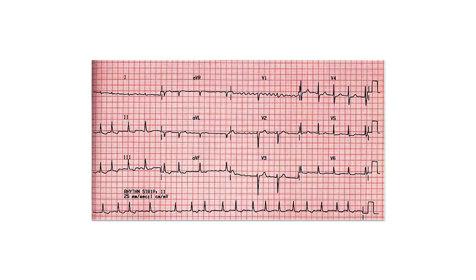Yes, and I remember a patient who came in with atrial fibrillation and with a rapid heart rate, and she was bound to get cardioversion until someone put the transducer on his chest and found out that it was severe aortic stenosis. Now, that really changes the management, doesn't it? Are you still not convinced? Well, we interviewed some experts in the field of emergency medicine, and here is what they said.